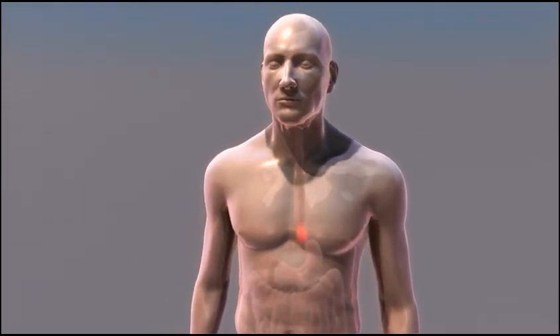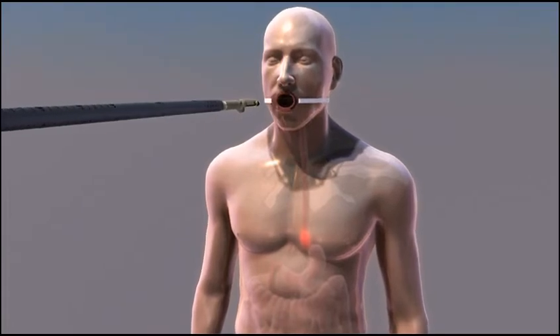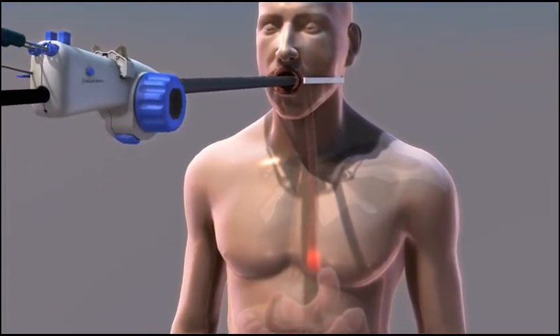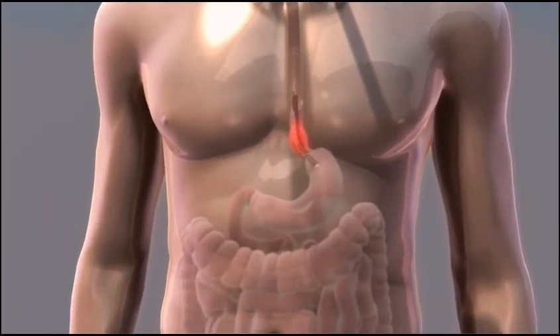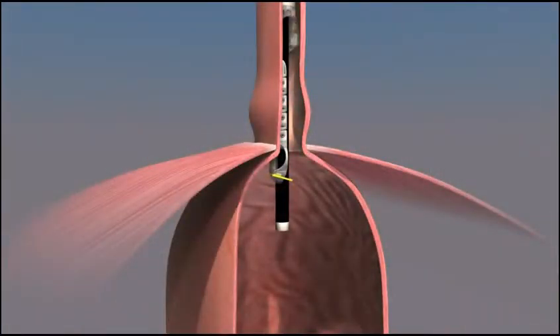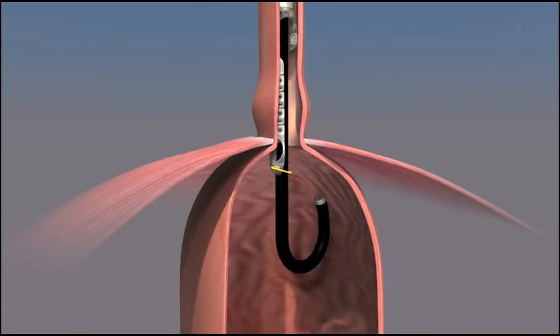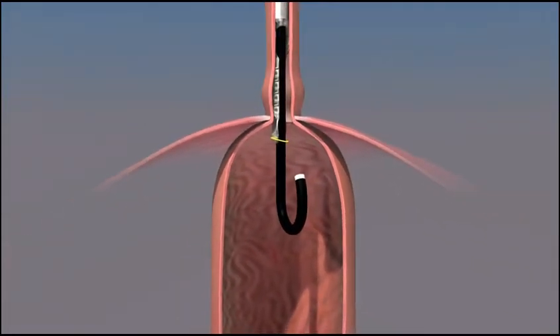TIF is performed under constant visualization by the surgeon. While the patient is under general anesthesia, the Esophyx device riding over the endoscope is gently glided down through the patient's mouth into the stomach. The stomach is inflated and the endoscope is advanced and turned so that it is looking up at the entrance to the stomach. This is where the anti-reflux valve will be created.